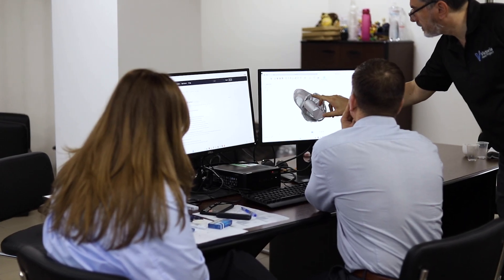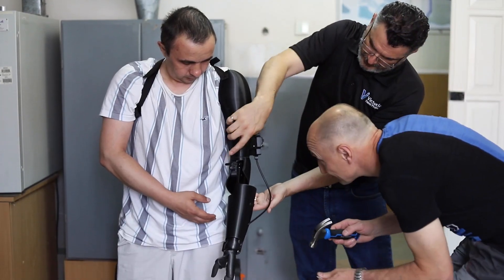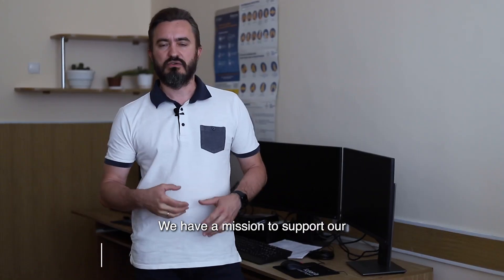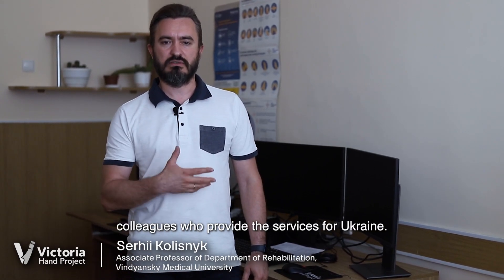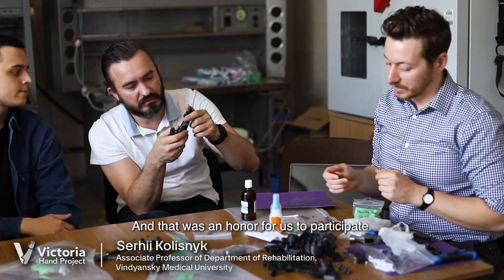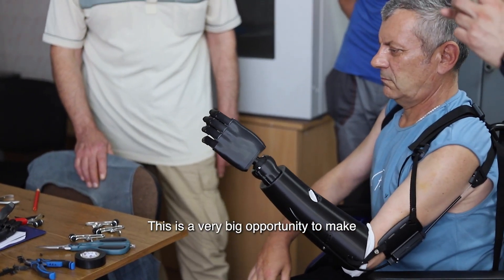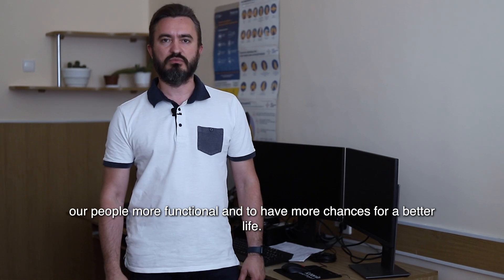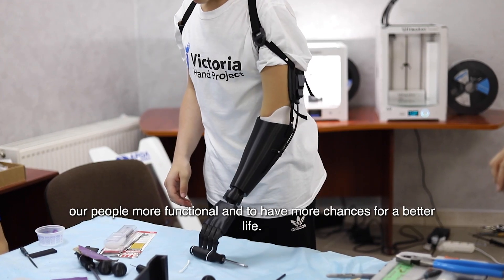Victoria Hand Project was very uniquely placed in which we bring these 3D printers and this training to the clinics we work in, so that everything is produced in-house — Ukrainians making hands for Ukrainians, in-country, on-demand. We have a mission to support our colleagues who provide the services for Ukraine, and that was an honor for us to participate. This is a very big opportunity to make our people more functional and to have more chances for a better life.